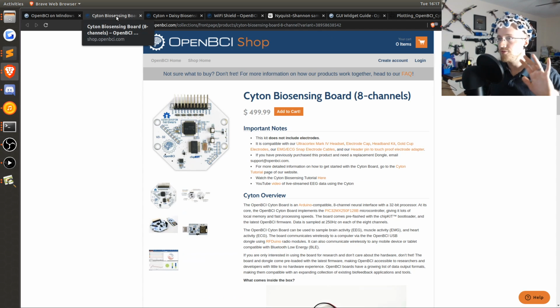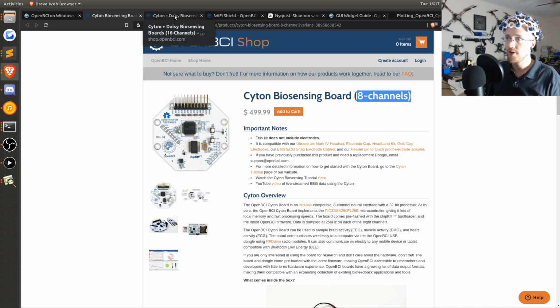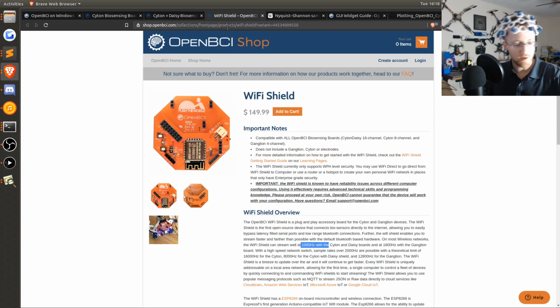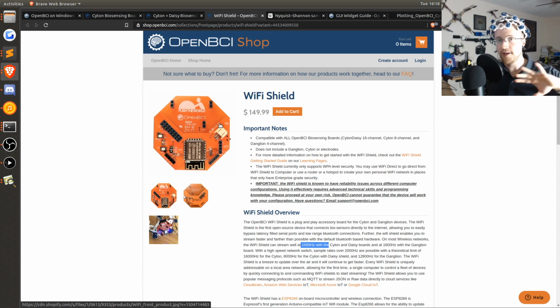Next, just to solidify the actual sampling rate, the Cyton board alone, which is 8 channels, will give us 250 hertz sampling rate, and then the Cyton plus the Daisy board, so the board just sits on top, gets us to 16 channels, which is what I'm using. That is 125 hertz, and this is a limitation of the Bluetooth. This could be fixed with the Wi-Fi board, which I actually do have. I'm just not going to use it yet. I'm told the best word is experimental, so it can be kind of a finicky board to use. So I'm going to hold off on that until I've done some other R&D. But yeah, it definitely exists.